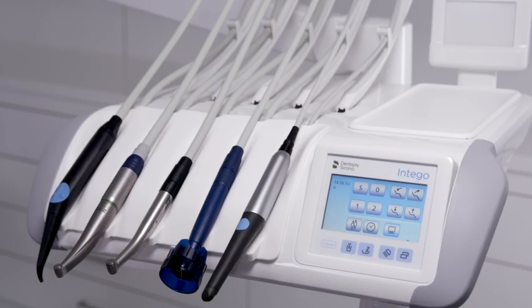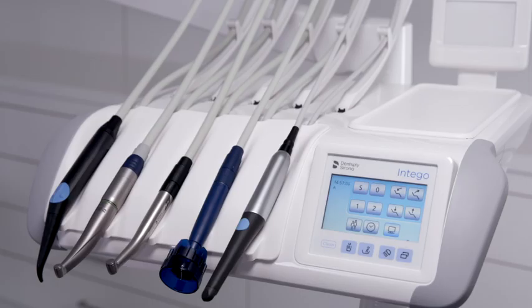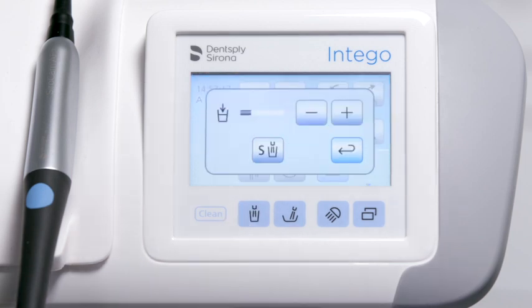The fixed keys are used to select additional functions, such as tumbler filler, cuspidor flushing, or operation of the dental operating light. You activate the functions by briefly pressing the button. Press and hold the tumbler filling button to go to the subscreen. You can link the rinsing of the tumbler to the rinsing position, and you can set filling quantity.